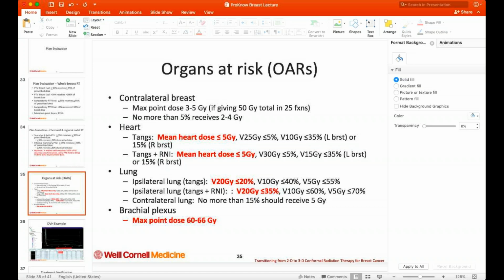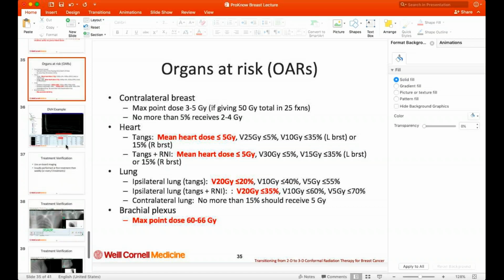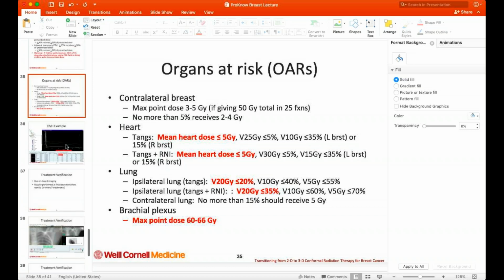Dr. Lulabuka asked, what is the indication of boost axillary dose, and what is the dose? So, let me put up my presentation again. So you want to give increased dose to the axilla if it's getting like 85% of what you want the axilla to get.